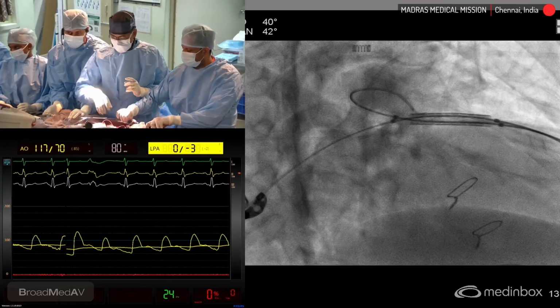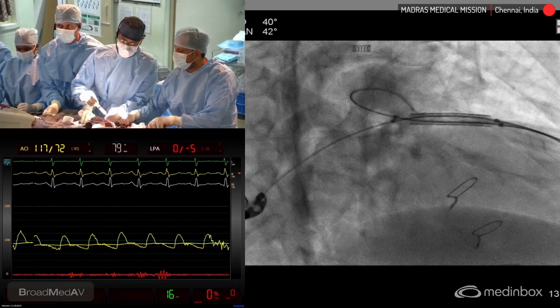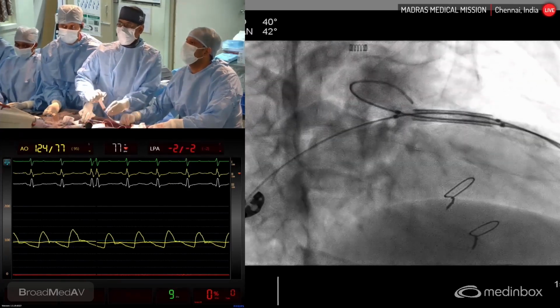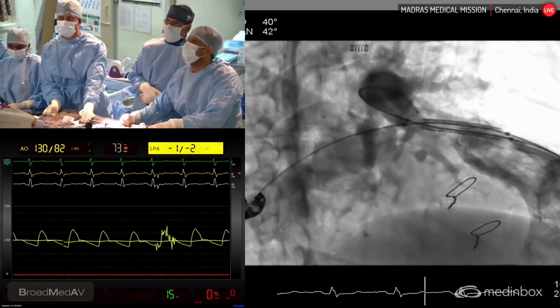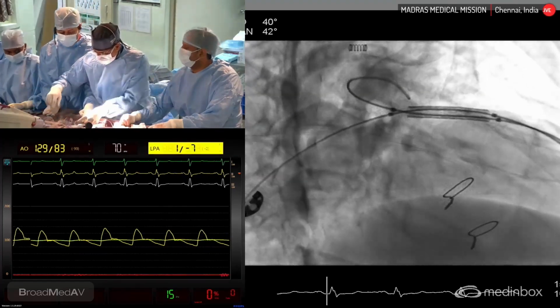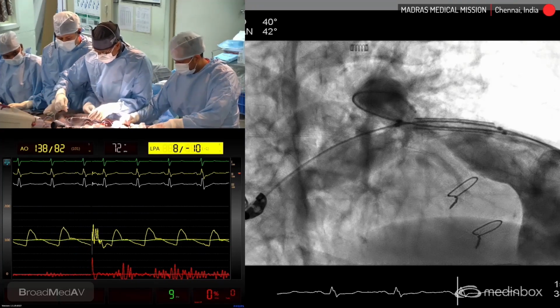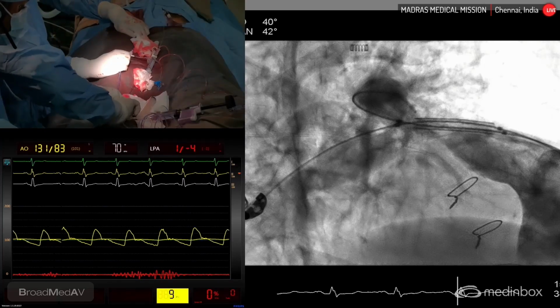Okay. So hold it here. We have almost reached the target. It's in the most distal part of the pulmonary artery. The left is going superiorly, right is going inferiorly. So at this point, this is connected to the indiflator. This is not connected. The second one also will connect to the indiflator.